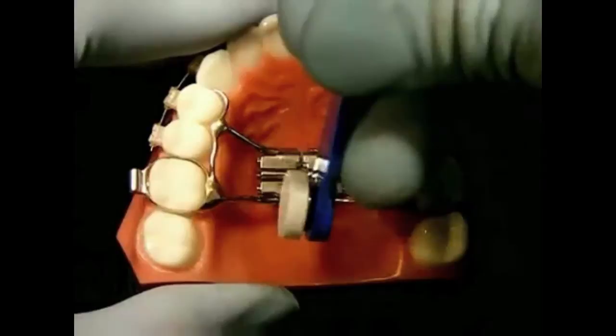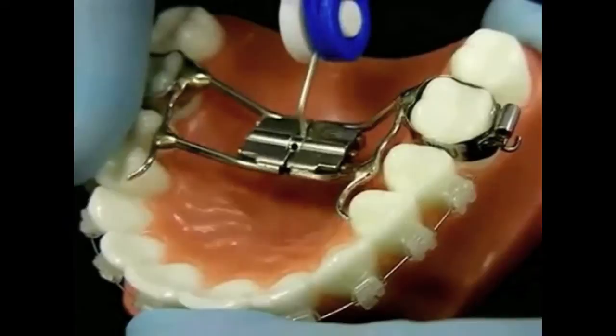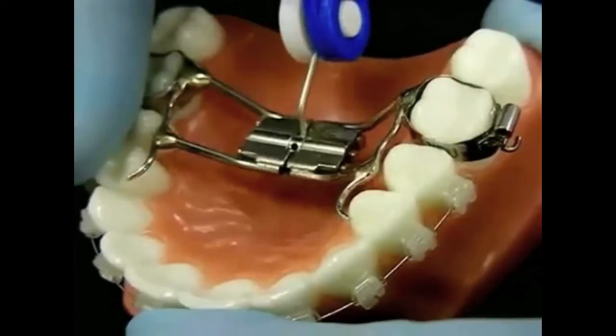To activate the palatal expander correctly: first, insert the key into the hole of the screw. Next, turn the screw by pushing towards the back of the mouth until you see the next hole in the screw. Then remove the key without turning the screw backwards. If you are activating the expander correctly, over time you may see a gap open up between the front teeth.